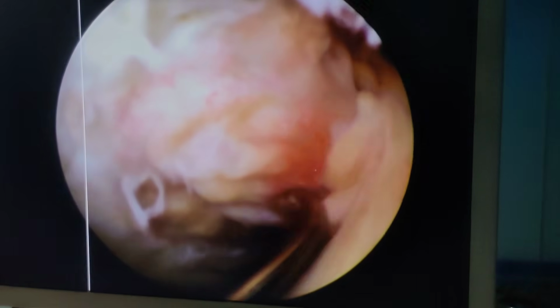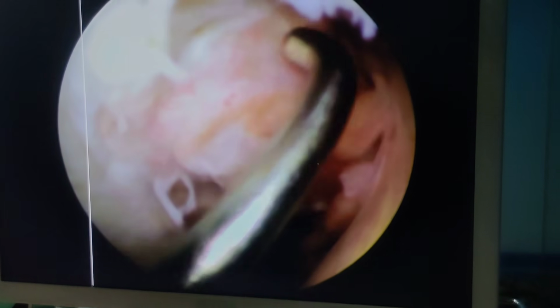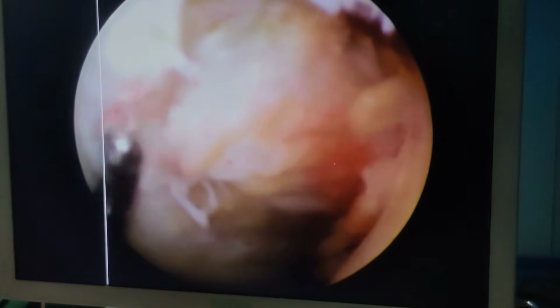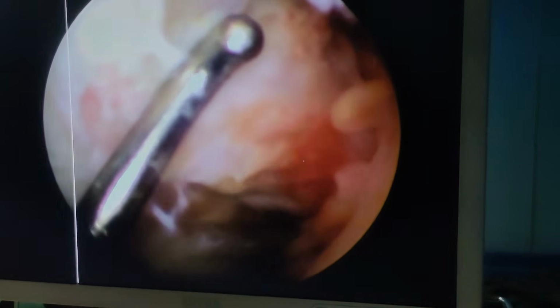So this is the lateral aspect of the medial femoral condyle. So this is the whole attachment of the PCL. Now the PCL has got 2 bundles. Anterolateral bundle is somewhere there. So it's right up the notch, very close to the articular surface. So the anterolateral bundle is the main bundle, and this is very close to the articular surface.